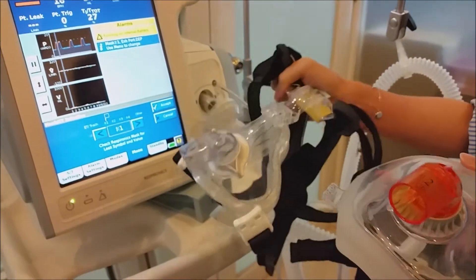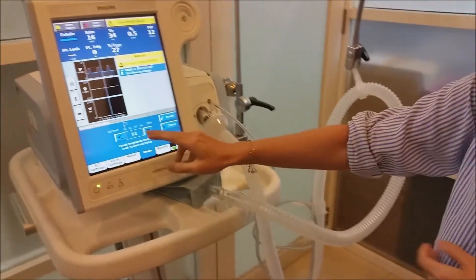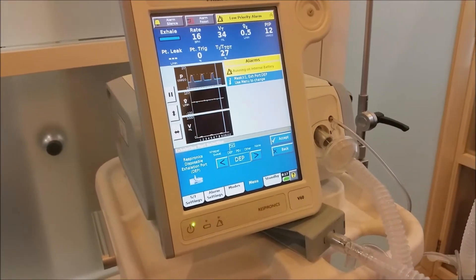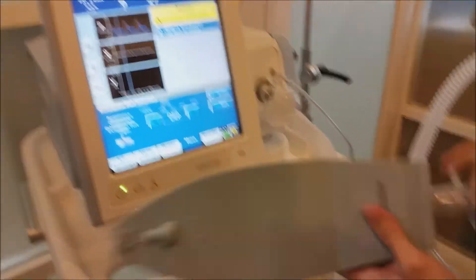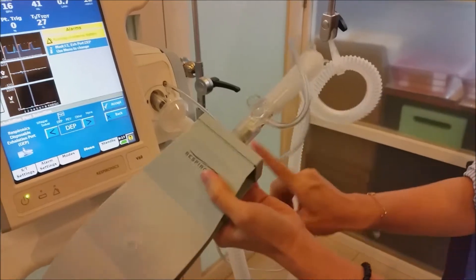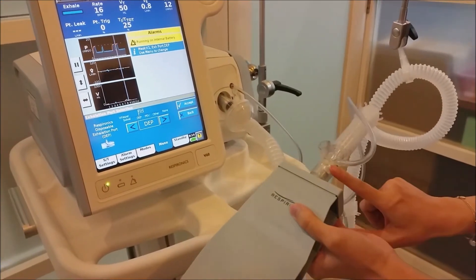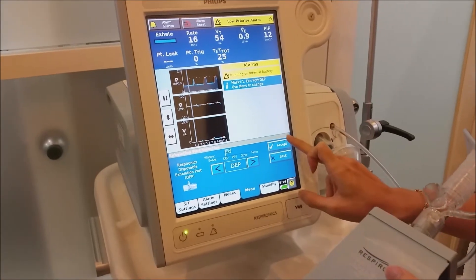So, whichever circuit and whichever mask — the interface that you pick — let's say, for example, you pick the oronasal mask, you go to number one and then select Accept. The next is your circuit exhalation port selection, which is over here. We are currently using DEP, which stands for Disposable Exhalation Port. This one shows DEP, so you just click Accept.